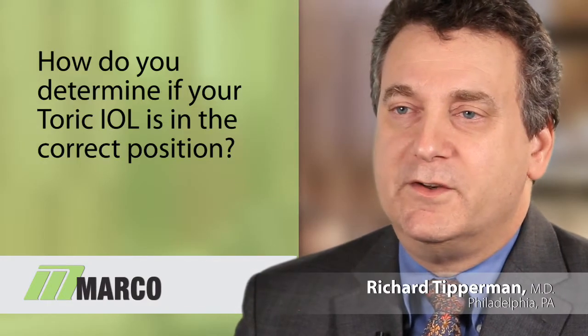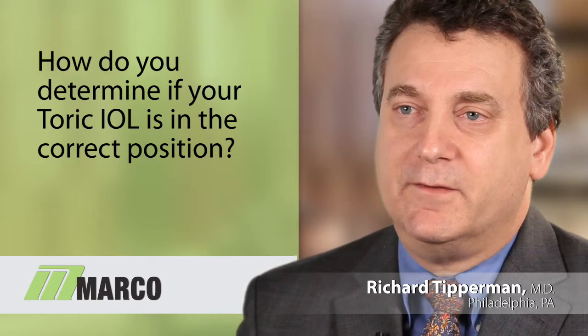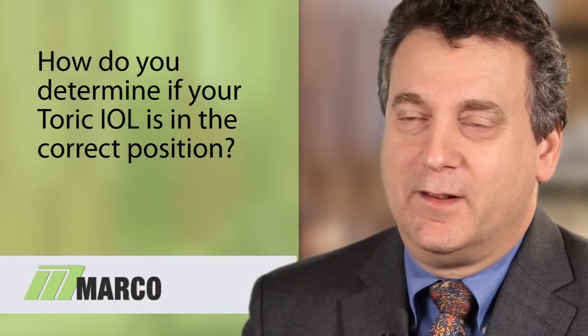Often at courses, physicians will ask, how do you determine if your toric implant is in the right position following cataract surgery, or if it's shifted? To some degree, pragmatically, if the patient is seeing well and doing well, it may be academic, and I'm less concerned about the position of the toric implant.